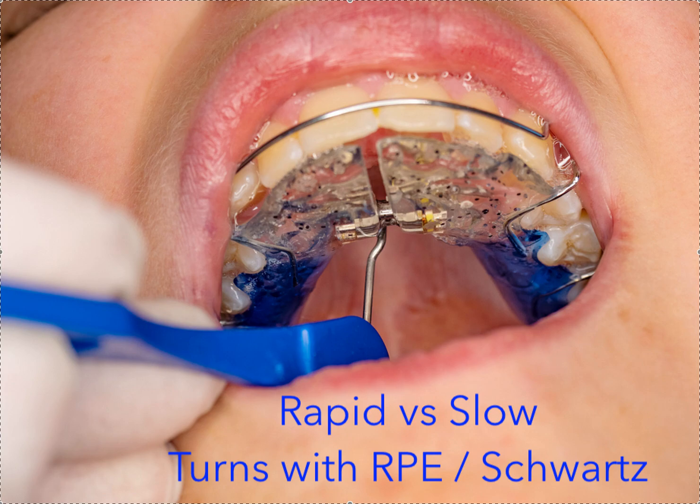Plus, it allowed me to keep the same instructions for a removable versus a fixed, because I don't do rapid expansion in a Schwartz. I only do rapid in a fixed banded appliance. So that way my assistants had consistent instructions, consistent handout. Front desk had consistent instructions. We always do it this way. This is the way we do it. Fewer side effects.